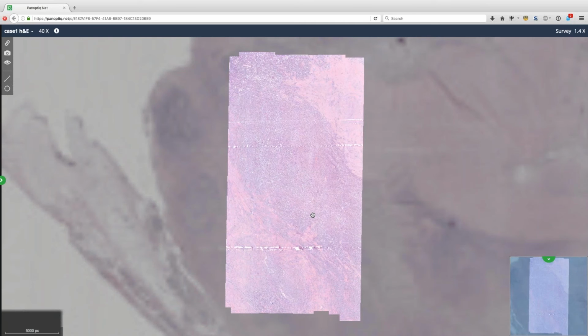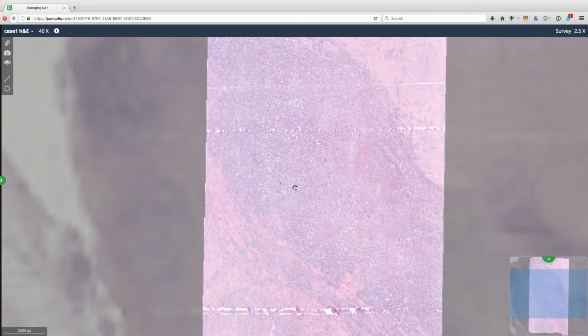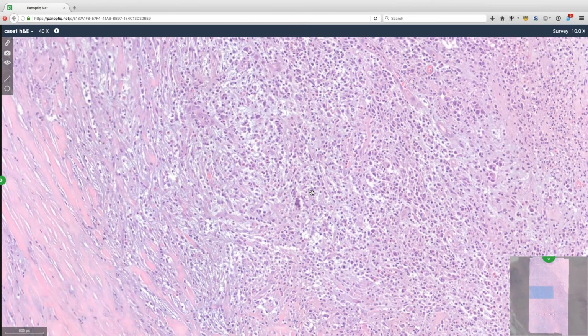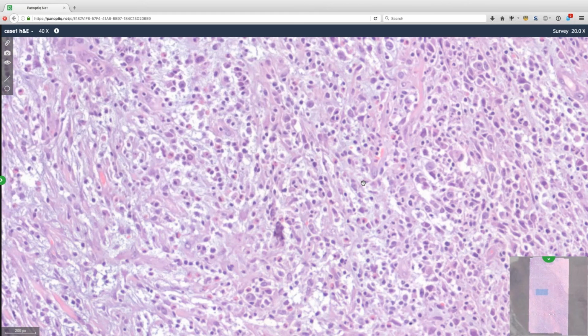But other than that, the morphology of the thymic Hodgkin's lymphoma is pretty classic for any other Hodgkin lymphoma in any other site, in which these large cells, the classic Reed-Sternberg Hodgkin cells, are admixed with a background that is composed of mixed inflammatory infiltrate. In this particular instance, the cells were pretty classic. They were large, often had one or more nuclei or nuclear lobes with prominent nucleoli.